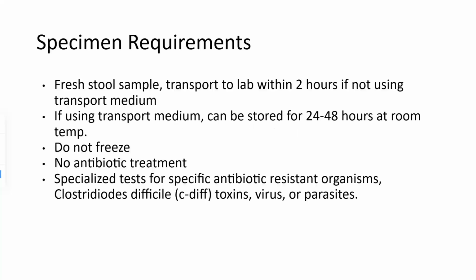Stool culture. So, specimen requirements: a fresh stool sample transported to the lab within 2 hours if not using a transport medium. Otherwise, if you're using a transport medium, it can be stored for 24 to 48 hours at room temperature. You don't want to freeze stool for a stool culture. You also want to get the stool culture done before antibiotics are started.